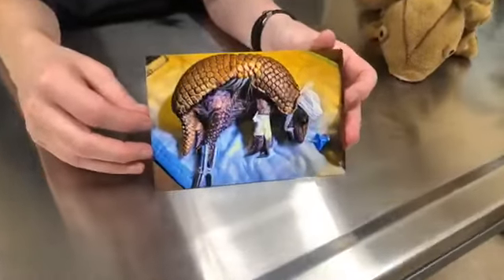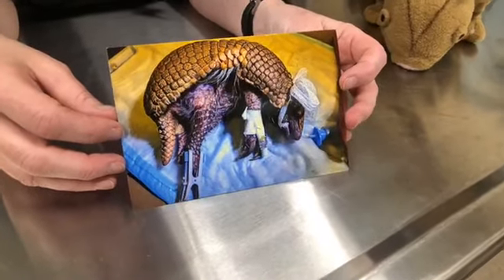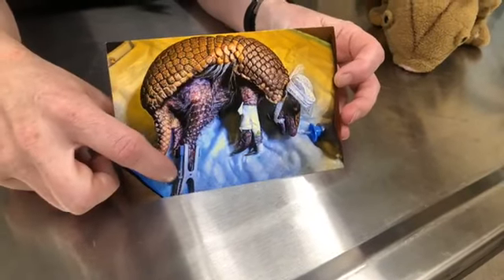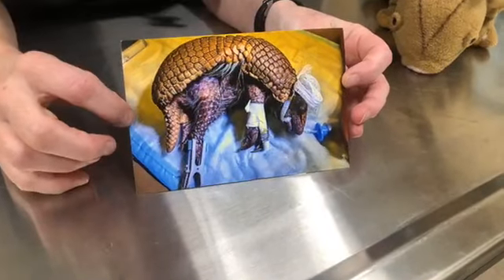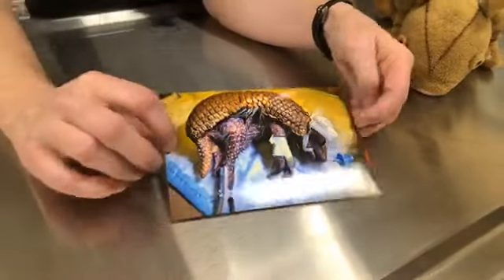She just had a little mass near her bladder, and she's doing great now. But you can see she's intubated just like everybody else. She has a little pulse ox clip on her foot. And we had placed an IV catheter in her little tiny leg. I'm pretty proud of that catheter, actually. But yeah, she's doing great.